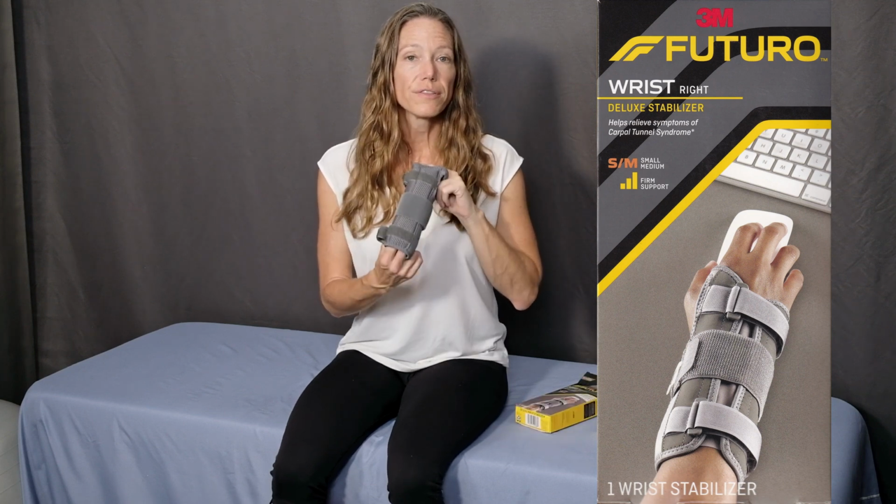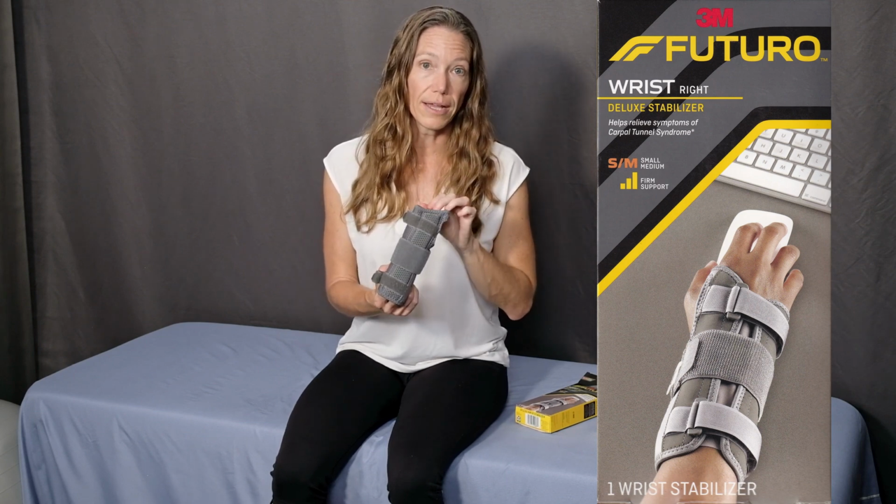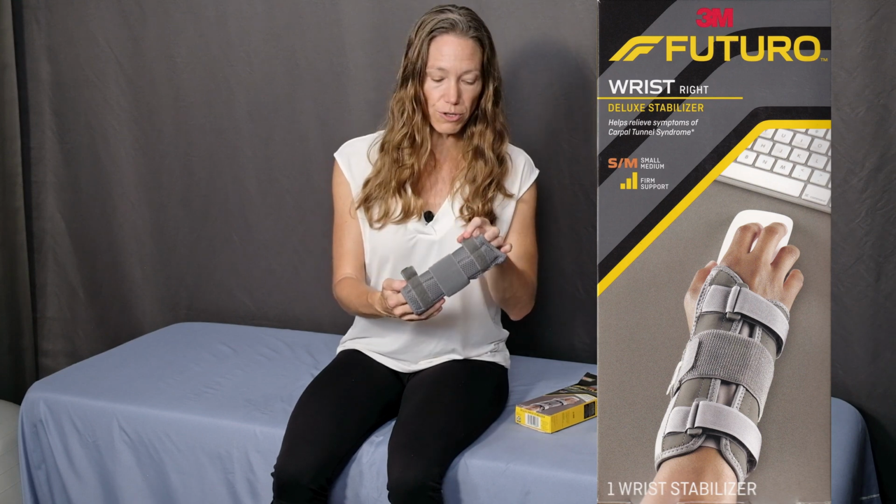On the package, this brace is specifically labeled small, medium size for the right hand. So first we'll unstrap the Velcro.